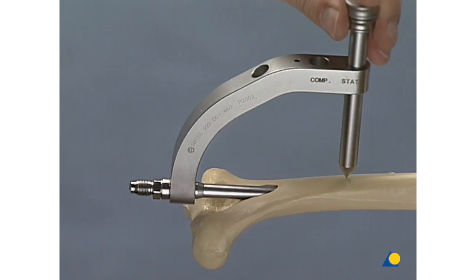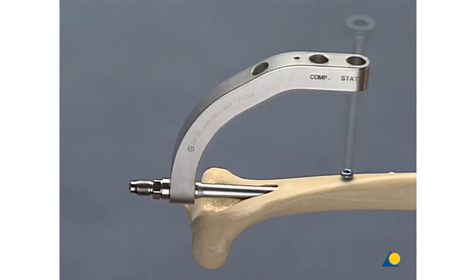Distal locking is achieved with the standard locking technique, guided with the insertion handle.